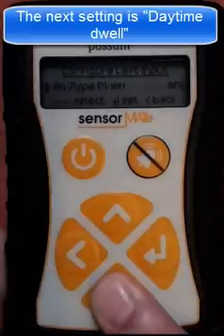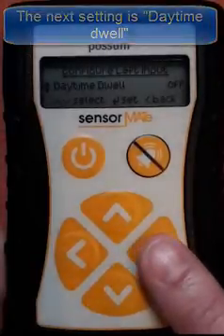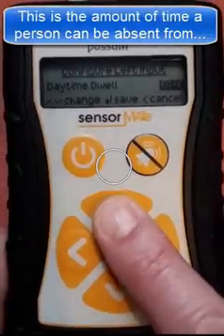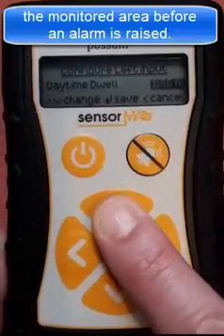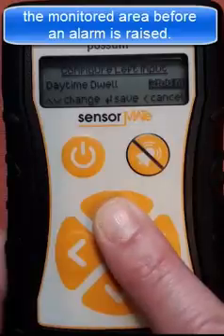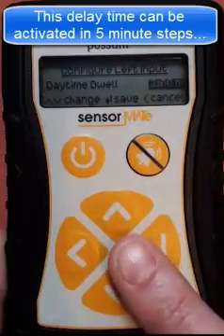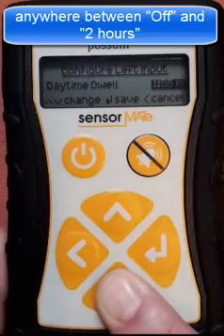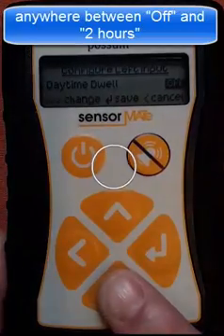The next setting allows the daytime dwell to be adjusted. This is the amount of time a person can be absent from the monitored area before an alarm is raised. This delay time can be activated in 5 minute steps, anywhere between the off setting and 2 hours.